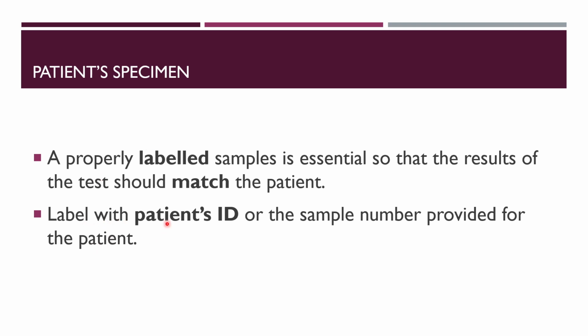At that time, when they are using registers and computational barcodes, they use the patient's ID or the sample number. That makes it easy to detect or guide the patient's sample to the particular laboratory testing.